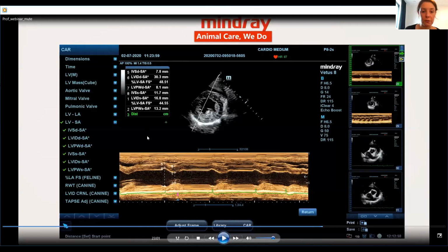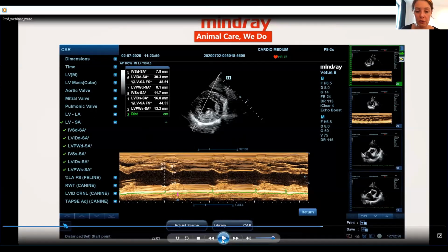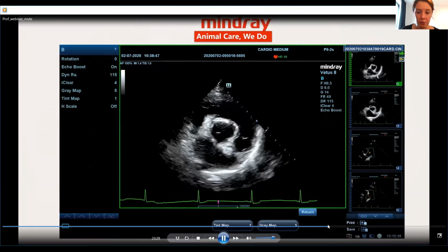Yeah, maybe one additional thing that I wanted to explain. So then here you see the different measurements, and your machine will automatically also calculate the fractional shortening in percentage, which is here actually perfectly normal for a healthy dog. It's one of the parameters that you can use to assess systolic function. When you measure a volume, that is something that I didn't explain before, the machine will also calculate an ejection fraction, which is then also a measurement of systolic function. So you use all of them together to get an idea of the systolic function. But assessment of systolic and diastolic function is again a different webinar, let's say.